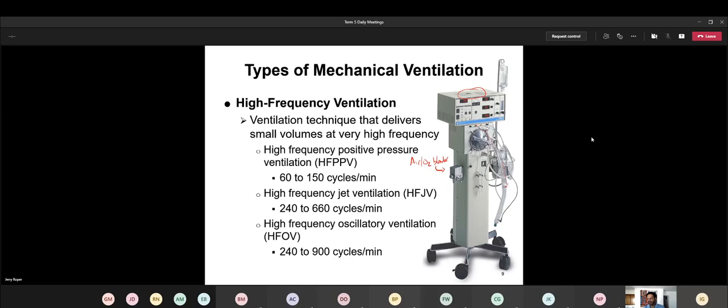And these are going to correspond to these diaphragms mostly. Like there's a diaphragm here, which is like a little valve. They call it a mushroom valve. And then there's one right here, and there's another one that you can't really see right there. And then there's your temperature probe that will sense the airway temperature for the heater.